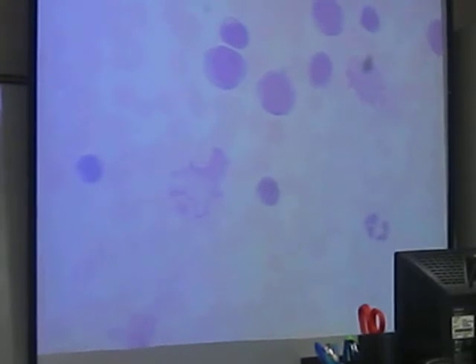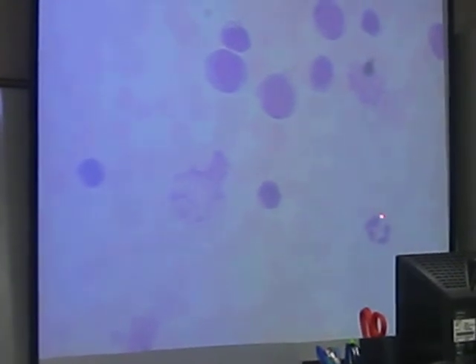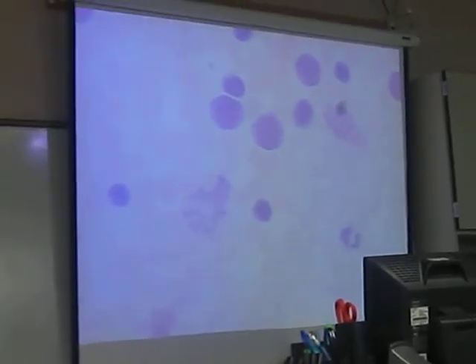Those would be the eosinophils. And then the basophils, it'll look similar, but the cytoplasm will be filled with all these dark little purple spots or granules. So that's how you're going to be able to differentiate between these three. Neutrophils, you're not going to see the granules. Eosinophils will have red or pinkish granules. And then the basophils will have more purple granules inside of them.